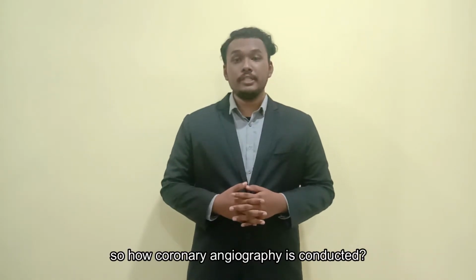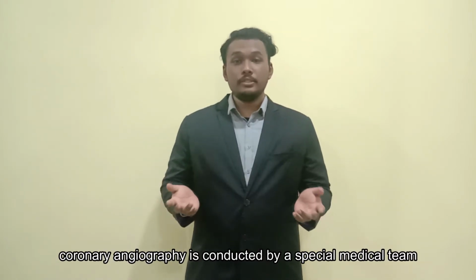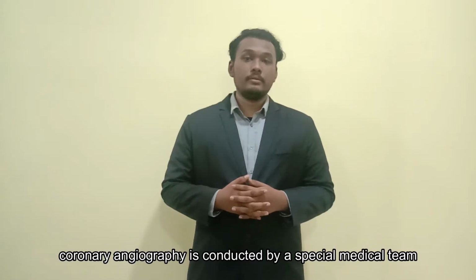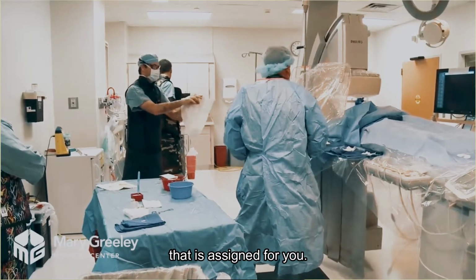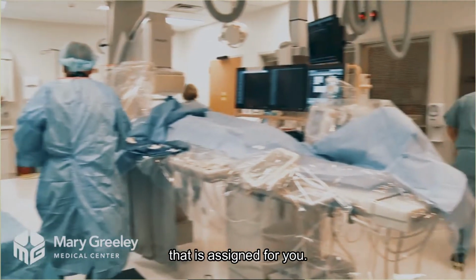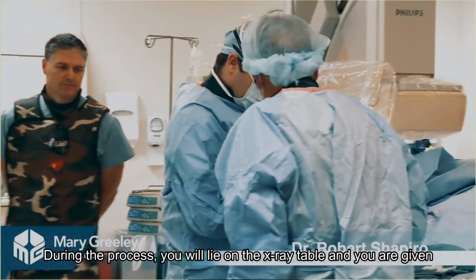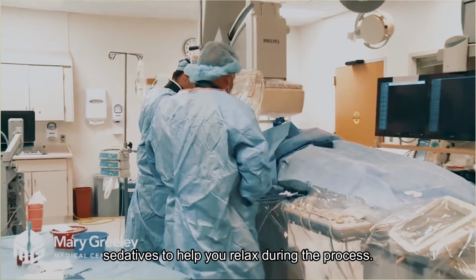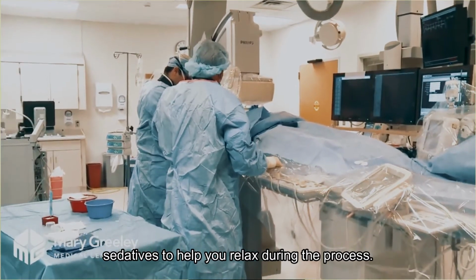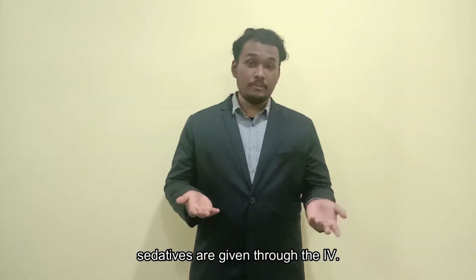So how is coronary angiography conducted? The coronary angiography is conducted by a special medical team that is assigned for you. During the procedure, you will lie on the X-ray table and you are given a sedative to help you relax during the process. Sedatives are given in the form of an IV.